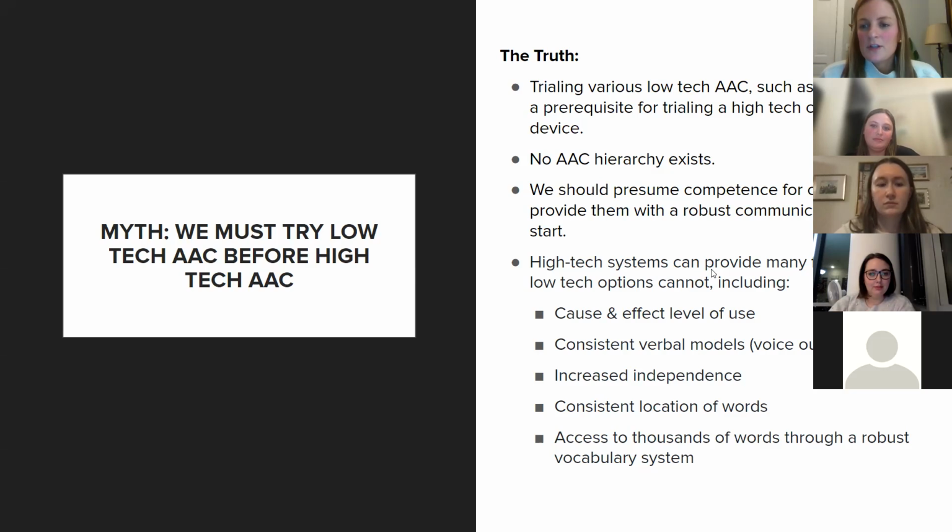Yeah, I think something else too with those AAC systems, like Emily said, we can talk to your SLP, because one way to do that is making a My Phrases page, and then you can even put your voice on there so that it has more intonation, because that can help. And then also just modeling some short phrases, right? Not just the single words, but modeling some of those short phrases and modeling those often and consistently.